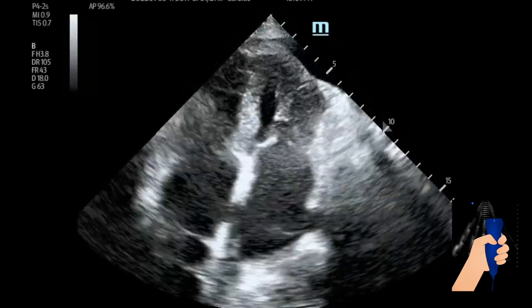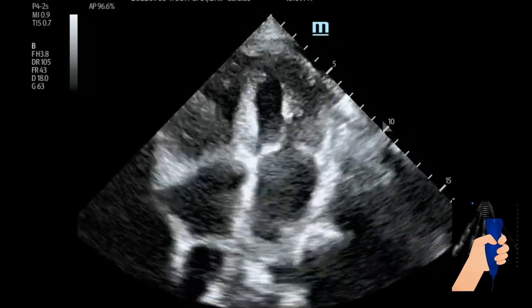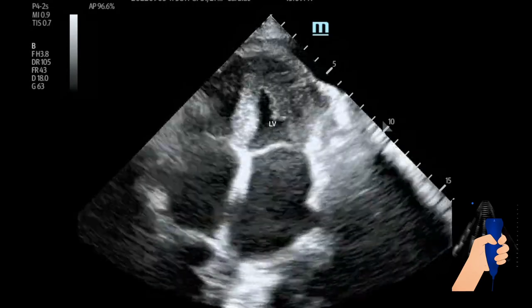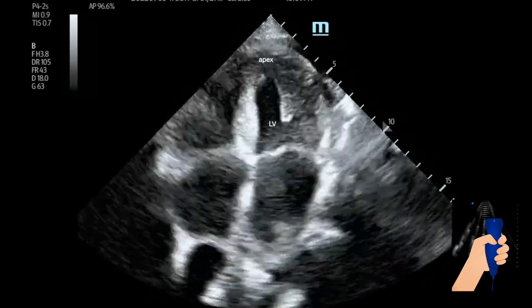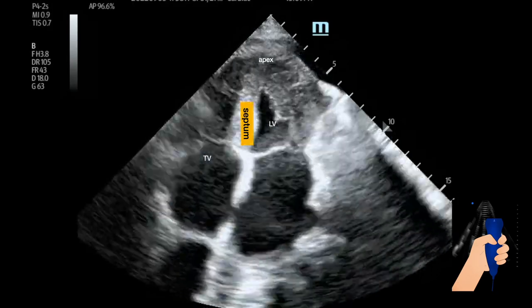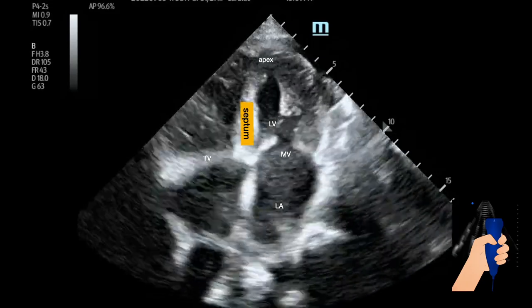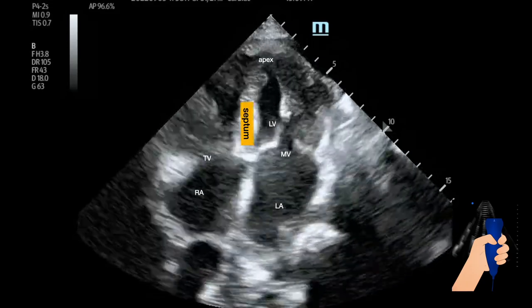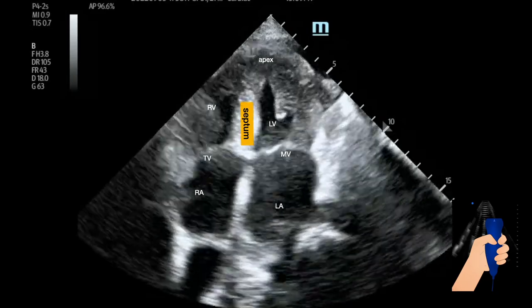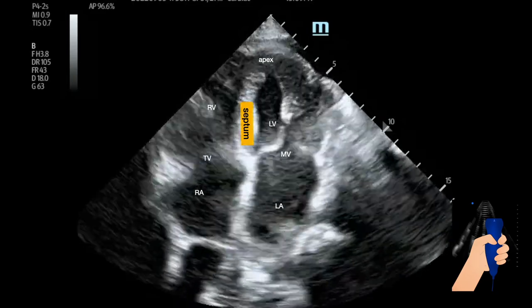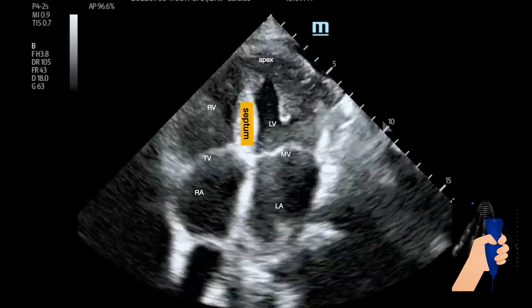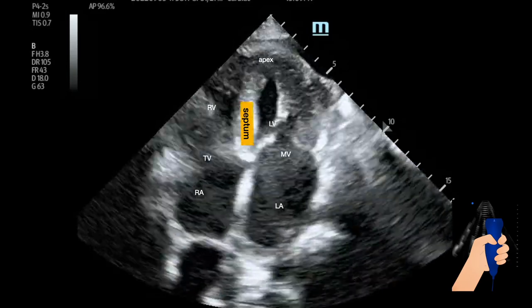This is a different patient again, using the cardiology convention with a phased array probe. The left ventricle, the septum, the tricuspid valve, the mitral valve, the left atrium, the right atrium, and the right ventricle. Although this patient has a normal left ventricular ejection fraction, you can see that the walls are significantly hypertrophic and both atria are enlarged.